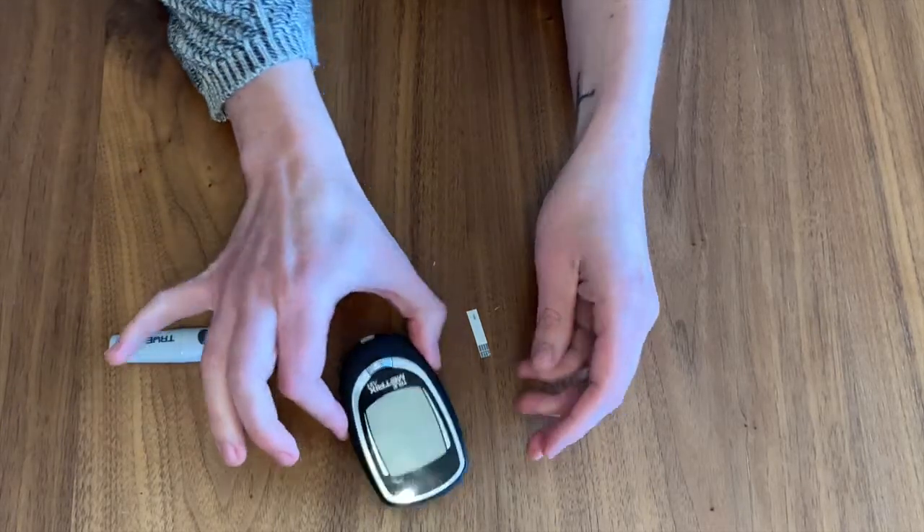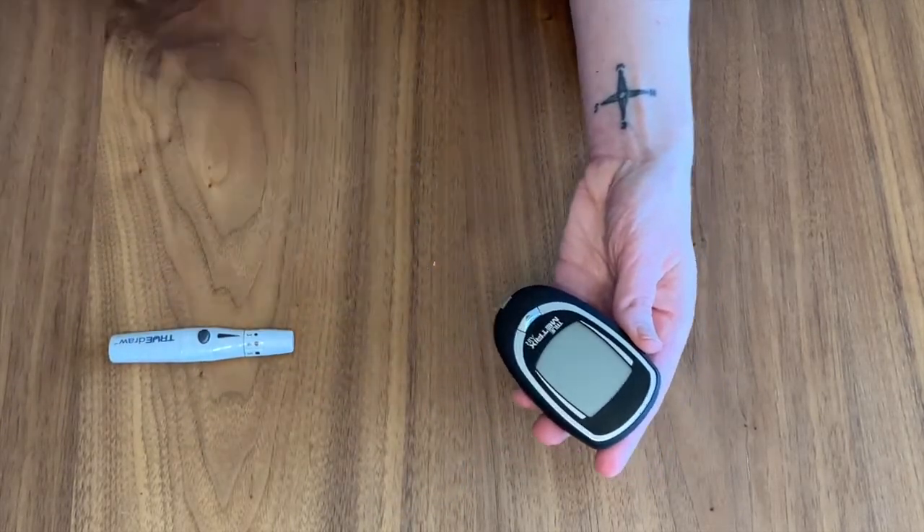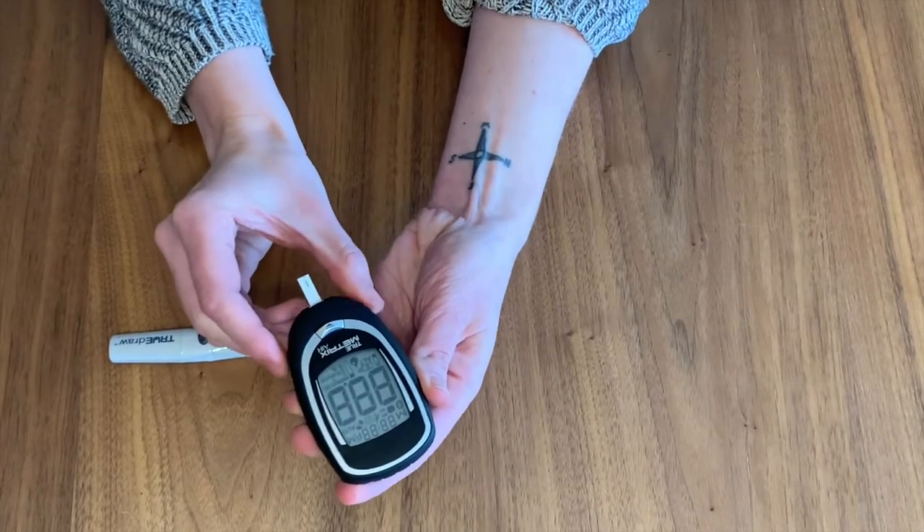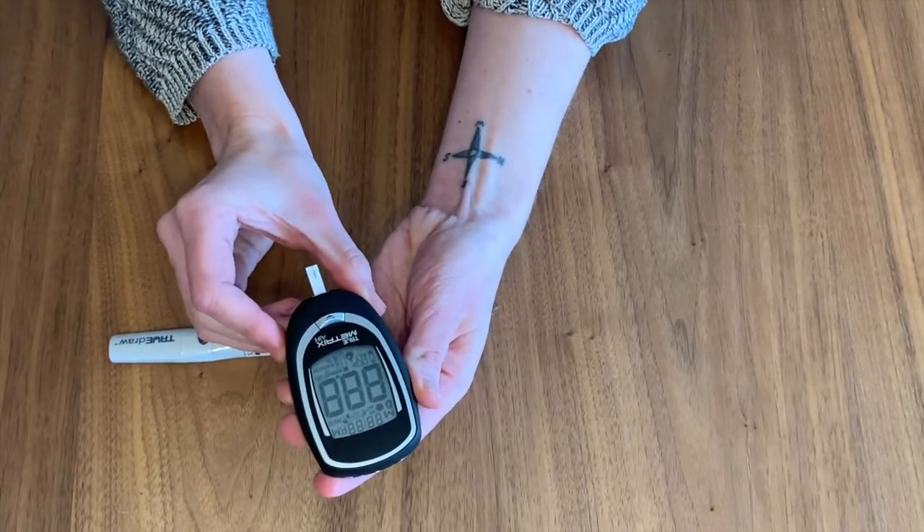Next, turn your machine on by inserting a strip into the slot. When you do this, the machine will turn on within a few seconds and you will see a flashing drop on the screen. This signals that the machine is ready to use.